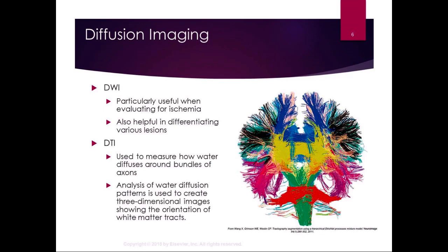And the other thing that I noticed, which I think is super interesting, is how in the cerebrum we see different things on either side. The white matter tracks are a little bit different from side to side. So even though I don't know how to analyze diffusion imaging, you can pick out some interesting things, but I think it's neat that you can visualize the white matter tracks as they are. And so they're probably, when they're looking for various lesions, they're looking for interruptions in those tracks. So just amazing the new types of imaging that are out there.